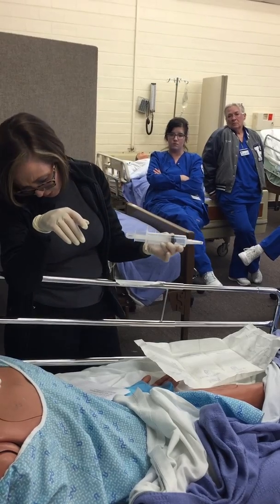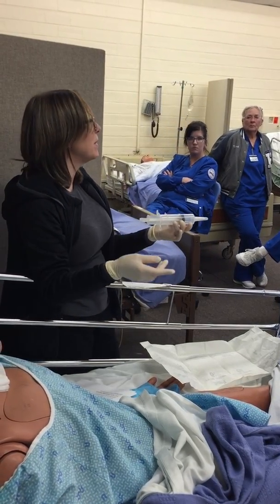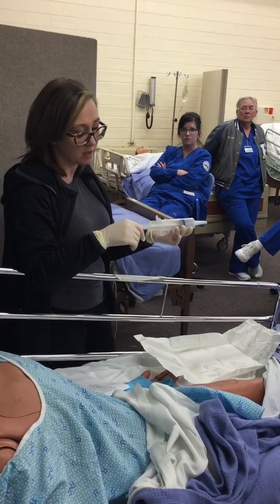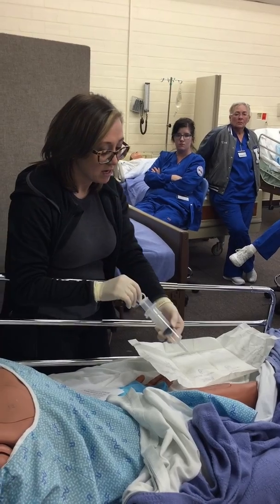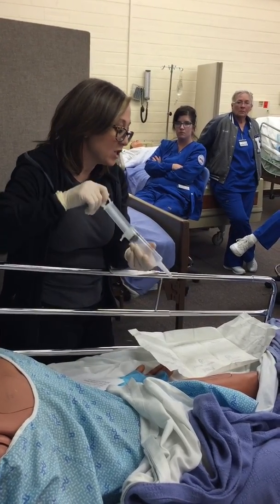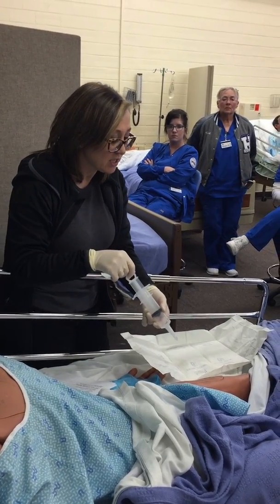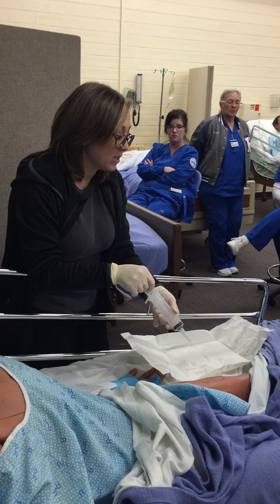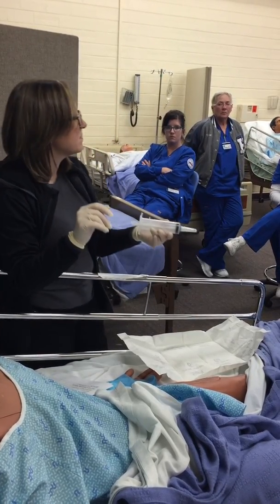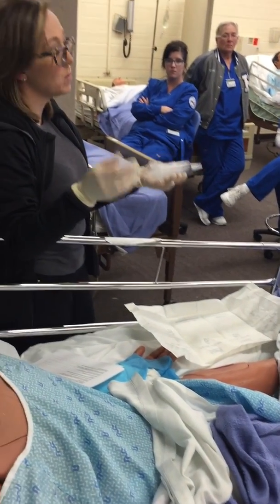Your checkoff sheet says you can use the basin to do that, but there's no way you're going to hold a basin and irrigate that unless you have eight arms. So this hand's still sterile. I'm going to do from the center out and the center out. And I will tell you guys, don't do that, because it's going to end up on you. It's just slow to remove that extra stuff, okay? So center out and center out, okay? If you need to go back over a couple times, go back over it a couple times. But you don't want to blast them.